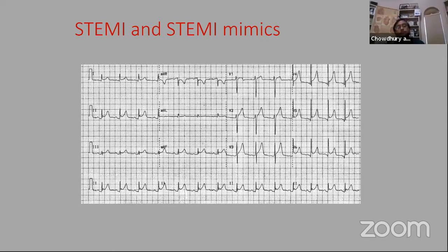any change of heart? From the audience, if you want to put an answer. So I request you that you don't jump on saying STEMI. Just say that this is ST elevation MI, sinus rhythm, and then interpret the ST elevation. Is it consistent with ST elevation MI or something else? Patient coming with chest pain. One thing that you do not have in the exam, you don't have the patient with you. In the clinical, in the emergency room, you have the patient with you. And feel free, if you cannot convincingly say that this is STEMI or STEMI mimic, you can ask me further questions if you want to.